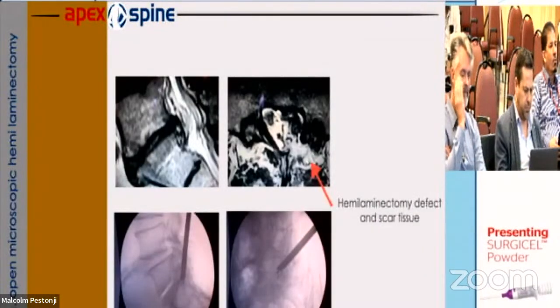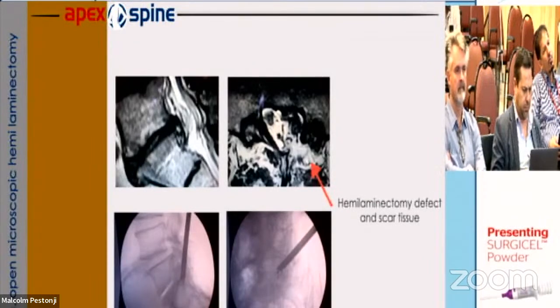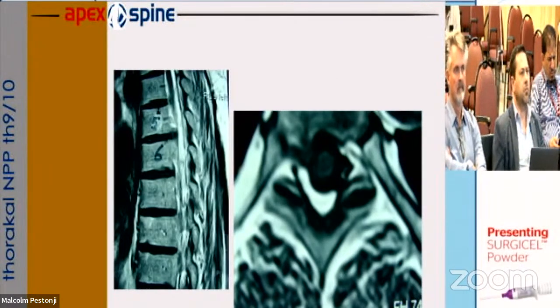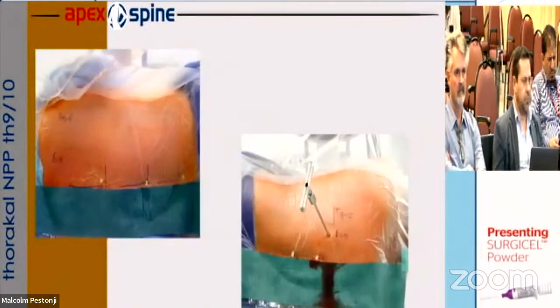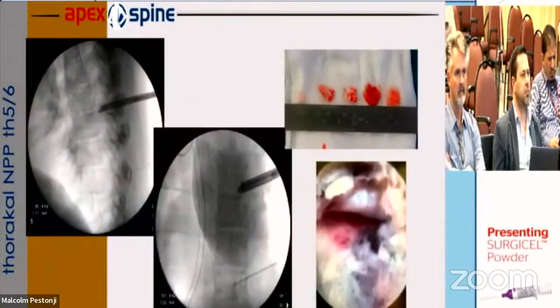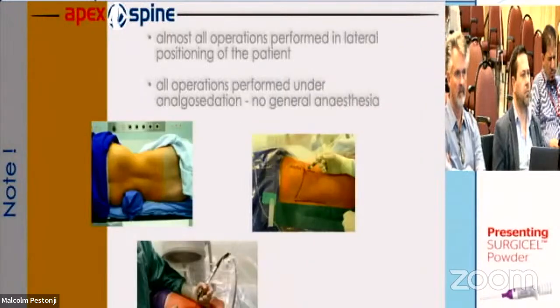And here another presentation of a pre-operated patient with a laminar defect, a lot of scar tissue. For the endoscopic procedure it was very nice. And nevertheless, disc herniation at level TH9-10. And here you see the marking, and then the approach is just 6 centimeters. And you do not have to go that far medial for reason of dural damage.